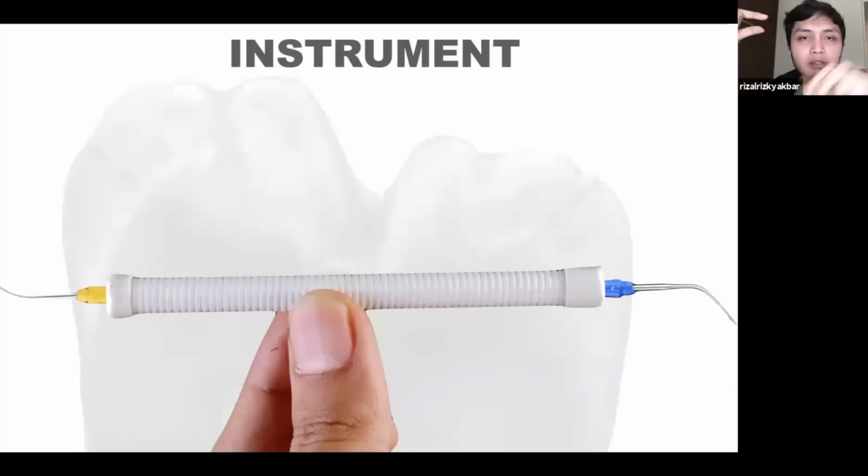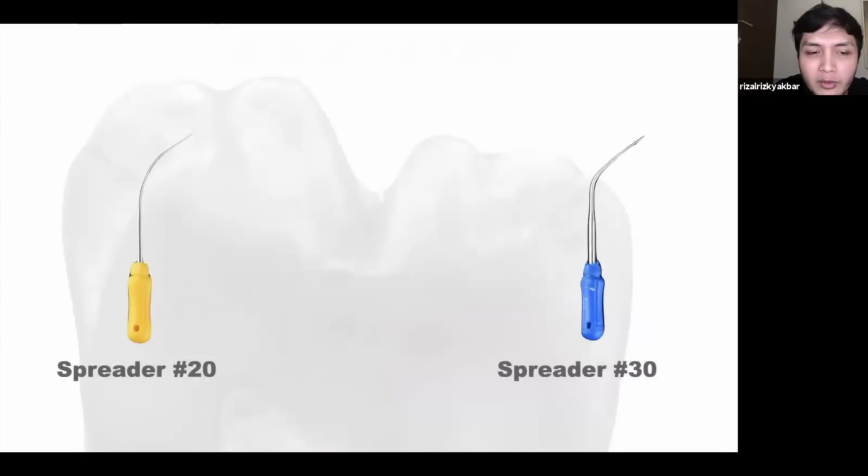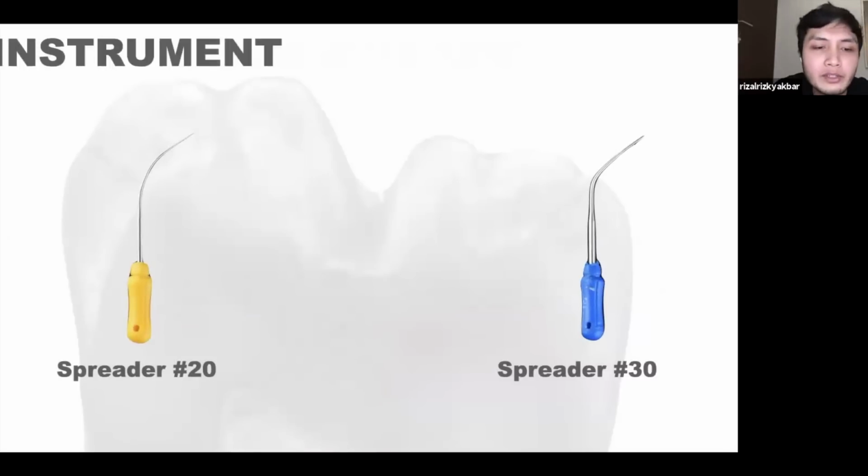But I was looking for an instrument which has very sharp tips, so I created one by myself. This is my custom instrument. This one is made from an endodontic spreader, the yellow one and the blue one. Why do I use the yellow one? Because the yellow one has a very sharp tip, and the blue one is rigid.